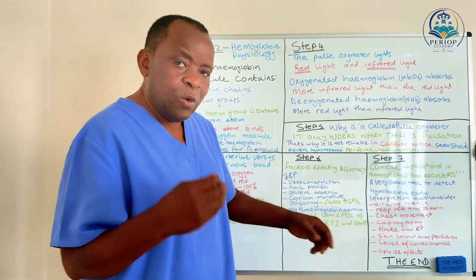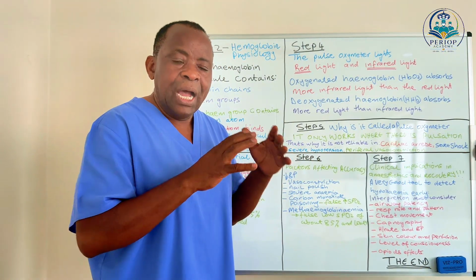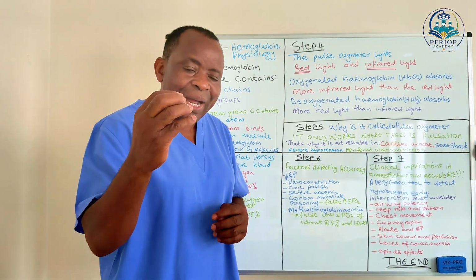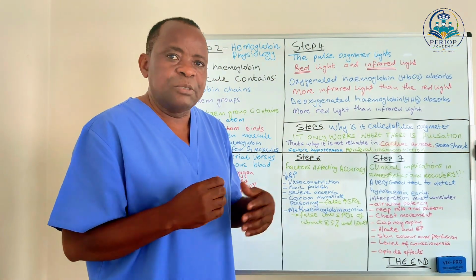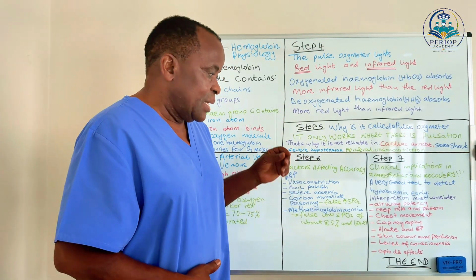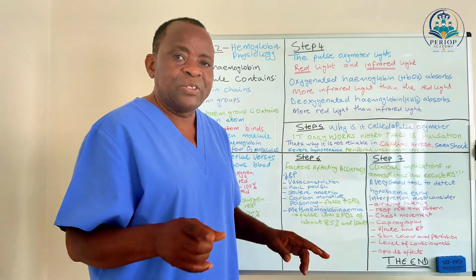And also assessment of the skin color and perfusion. Have a constant look. Understand how the patient's skin color is. If the patient is pink, warm, perfused, good. If there are any challenges, for example the patient is pale, ashen gray, or blue, you have to do a quick assessment and understand the parameters as they relate to ECG and pulse oximetry.